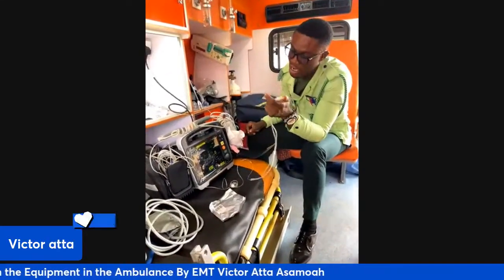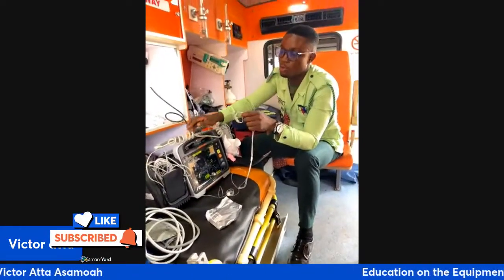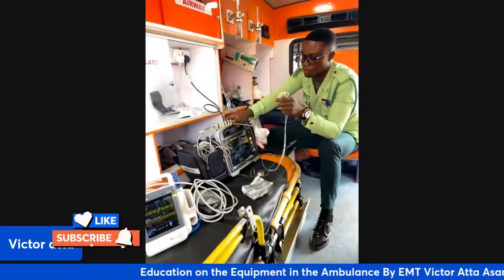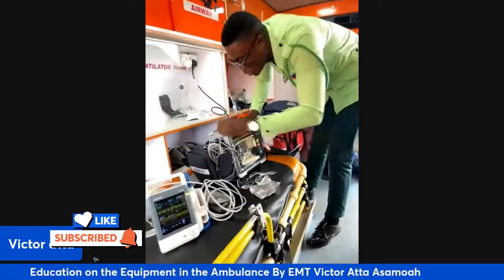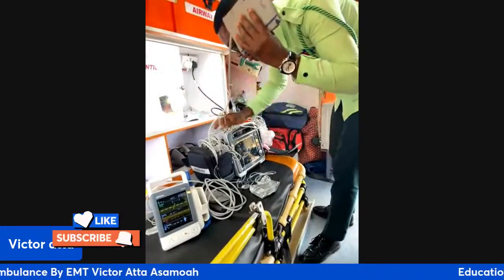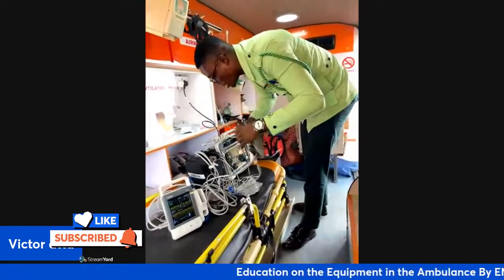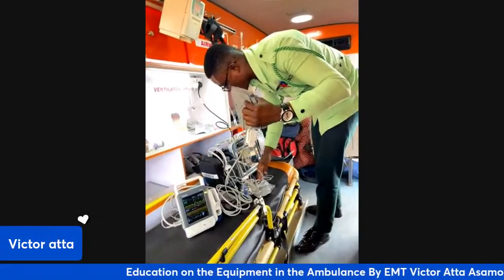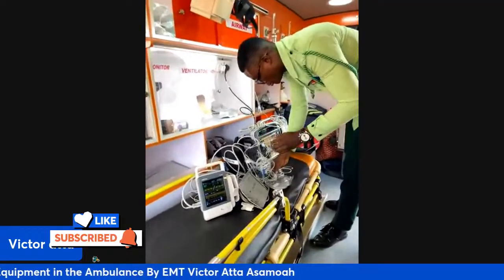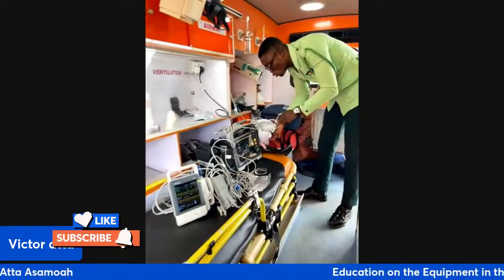He'll be experiencing bradycardia. So when you're using this machine, it allows you to know whether your patient is alive or not. Moreover, it also contains the temperature. So this is the BP curve, the pulse oximeter, and then the temperature. And also the temperature.